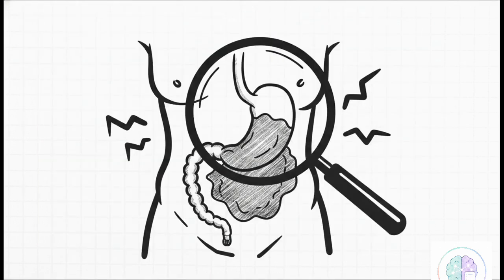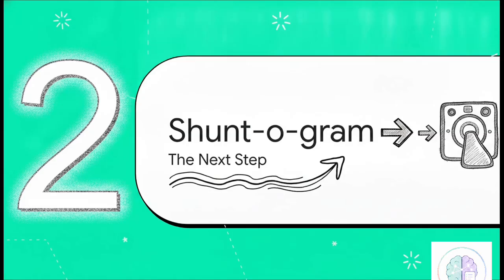And let's not forget the distal end of the whole setup, the abdomen. If you've got a case where undershunting is just totally unexplained by cranial imaging or X-rays, or if you heavily suspect a distal obstruction, you have to look lower. If the patient has abdominal pain, bloating, or signs of ascites or a pseudocyst, an abdominal CT or ultrasound is your immediate next step. All right, that brings us to Section 2, the shuntogram procedure.